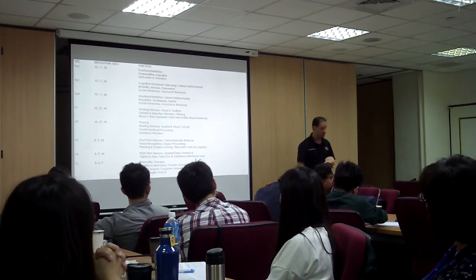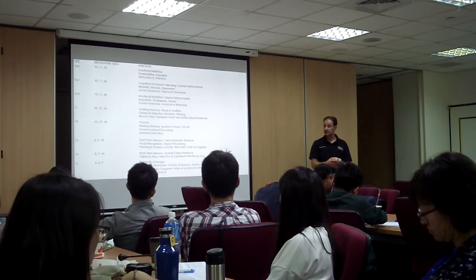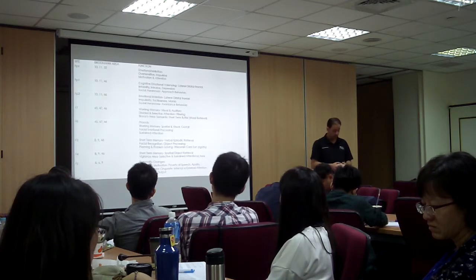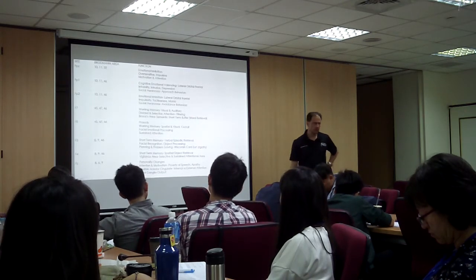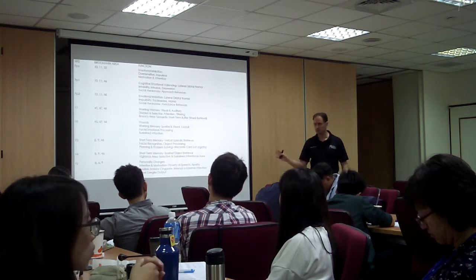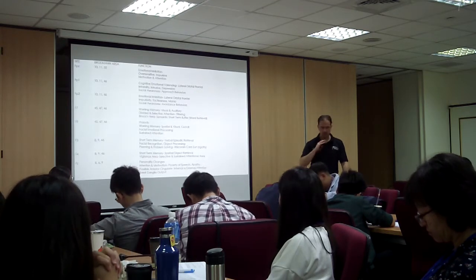Because the limbic system, one of the functions the limbic system regulates is what? Sleep. Okay. So FP1 with eyes closed, it's wonderful. I love it. I do it with a lot of clients, and they sleep better after 3 sessions. They go, oh my God, I'm sleeping better. I hadn't slept this way in 20 years, and it's wonderful.